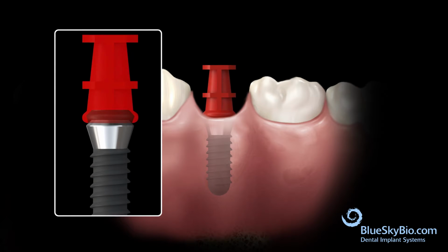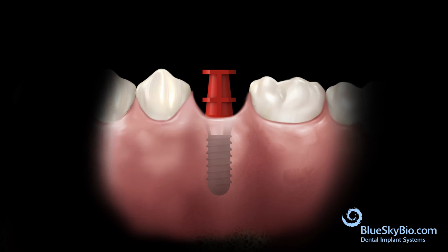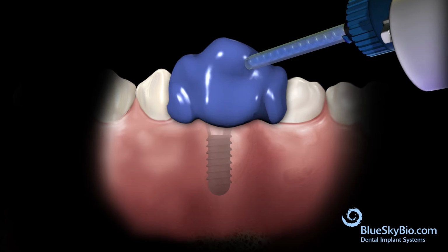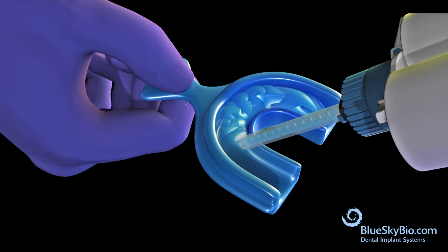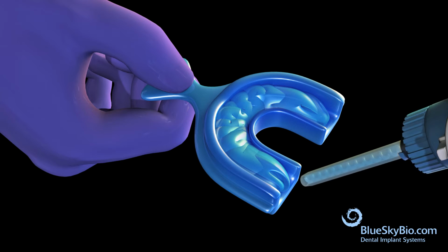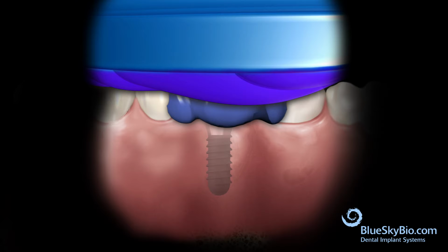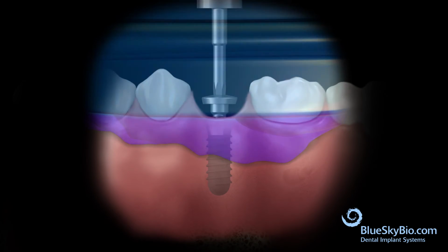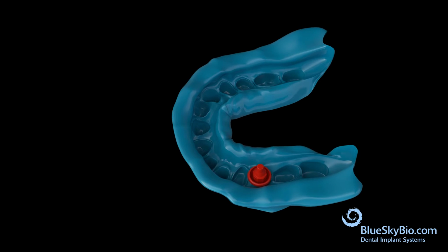Remove the cover screw from the implant. Snap the impression cap over top the implant. Inject impression material around the impression cap. Fill the tray with impression material. Insert the tray with impression material and then seat the impression to capture the dental arch. Remove the impression. Insert cover screw back into implant.